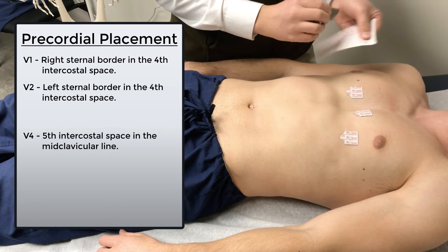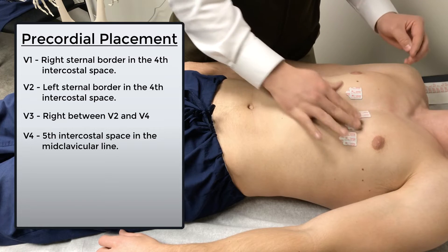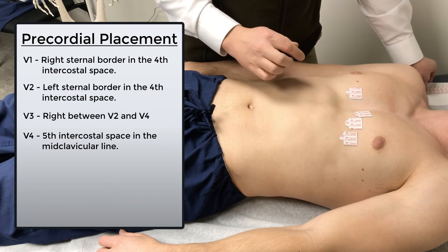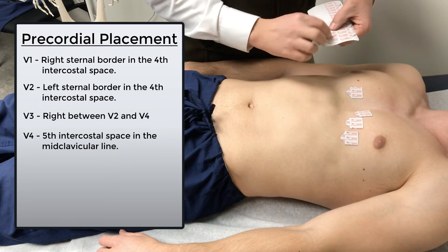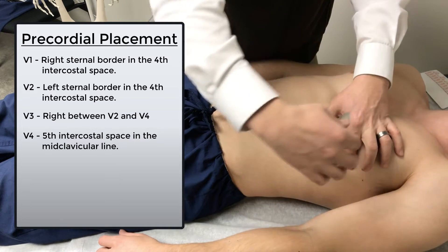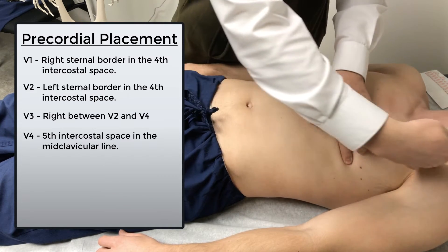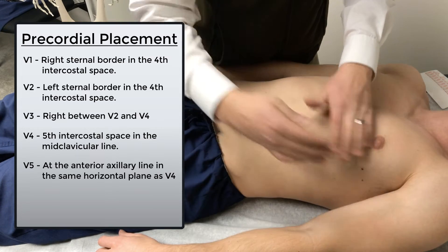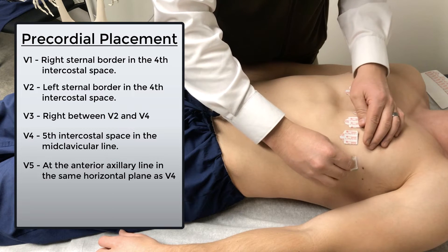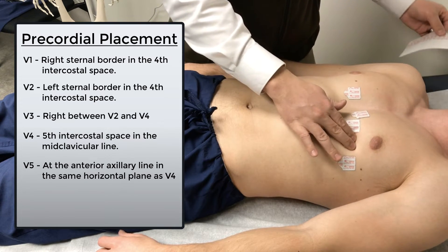V3 is easy because it's just right in the middle of V2 and V4. You don't have to worry about interspaces — just right between the two on that line. That's V3. For V5, we continue to follow that fifth intercostal space out. It should be in the same horizontal line as V4, out to the anterior axillary line, right where the patient's body starts to drop off down towards the table. We place V5 there — that's our first of the lateral precordial leads.